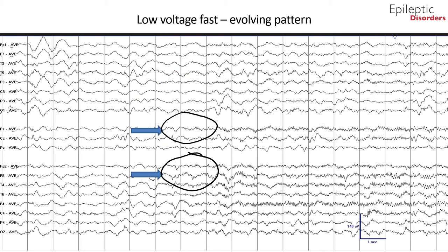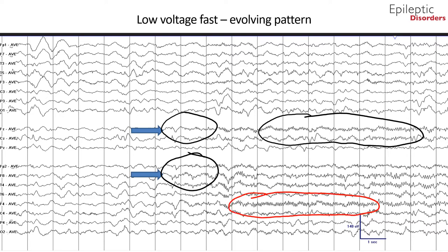This low-voltage fast frequency activity is outlined in the black circle. Additionally noted is spatiotemporal evolution of the seizure with involvement of adjacent F4 channels and temporal T4 and T6 channels towards the end of the page.